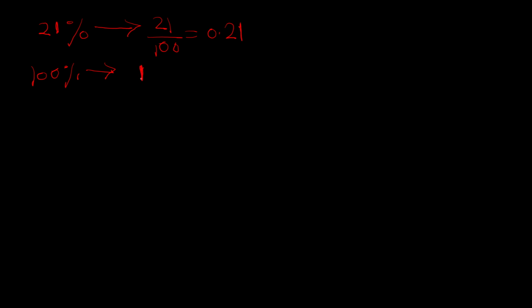Though we start with the highest possible, that is 100% oxygen, our aim is to gradually de-escalate it to the safer zone, as we are aware that even oxygen toxicity, oxygen free radicals because of hyperoxia, is deleterious to the patient.